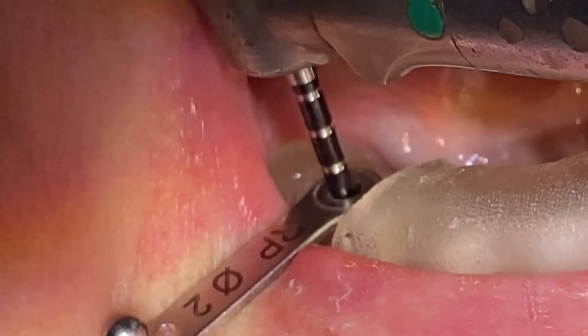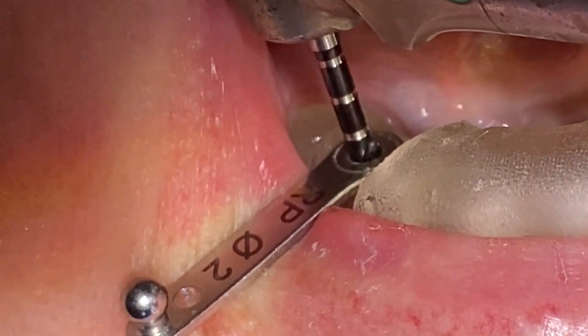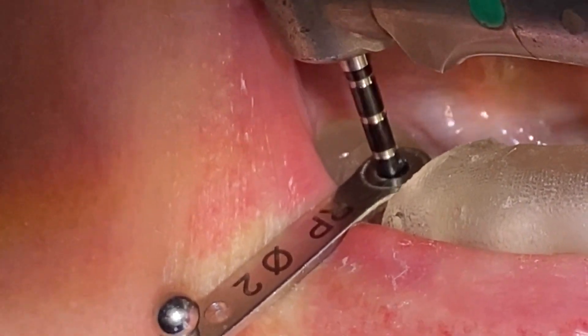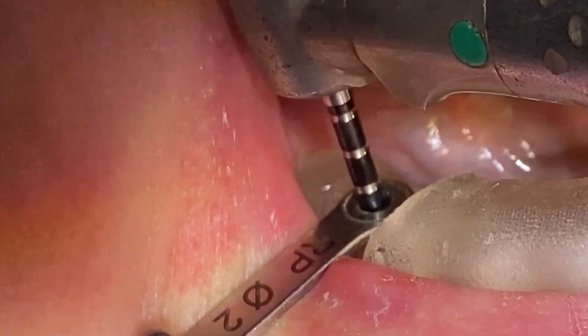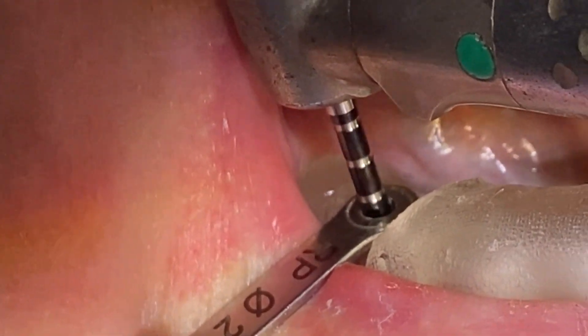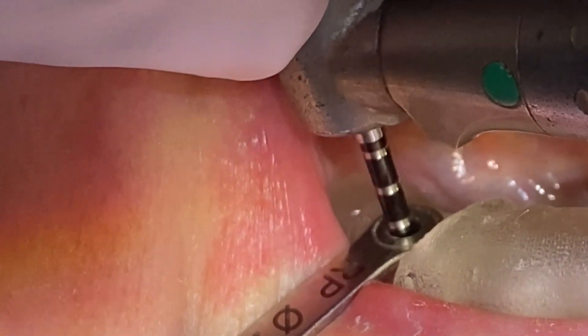I'm going to take it down to about 8.5, and then I'll actually start to do my disc cutting. I'm going to do a Hemi Disc Cut — I'll flap the buccal flap, and then I'll cut the disc out of the lingual flap. That way I'll maintain the keratinized tissue on the flap where I need it, on the buccal. This is where it's typically thinner.